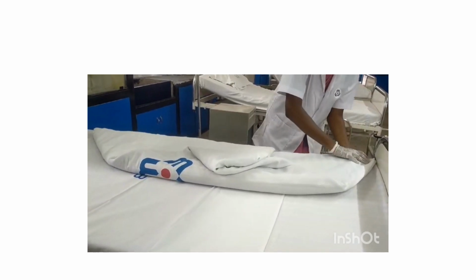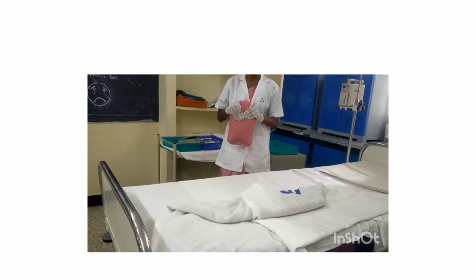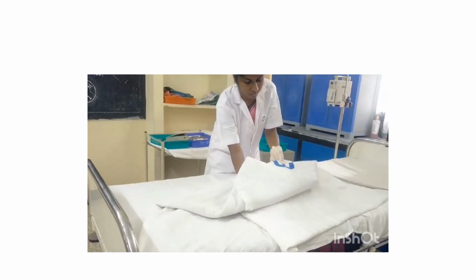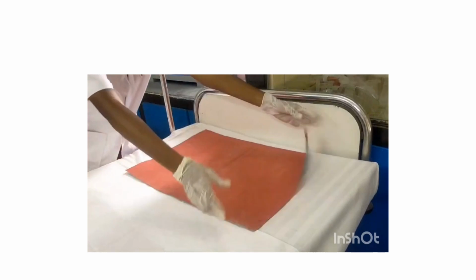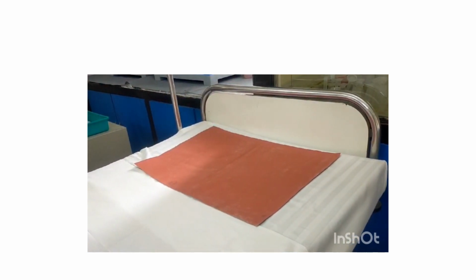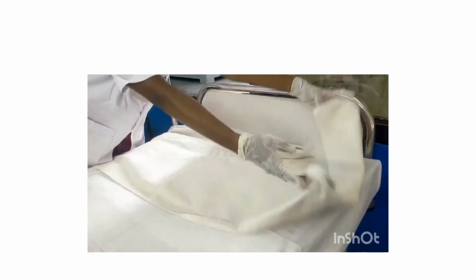Now come to the working side. Place the hot water bag beneath the triangular folded sheet. Now place the Macintosh at the head end, and after placing the Macintosh, place a towel above the Macintosh and tuck it on the sides.